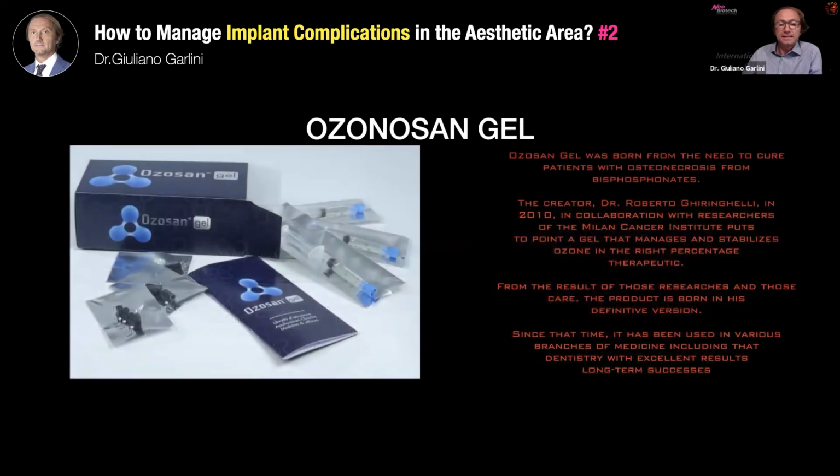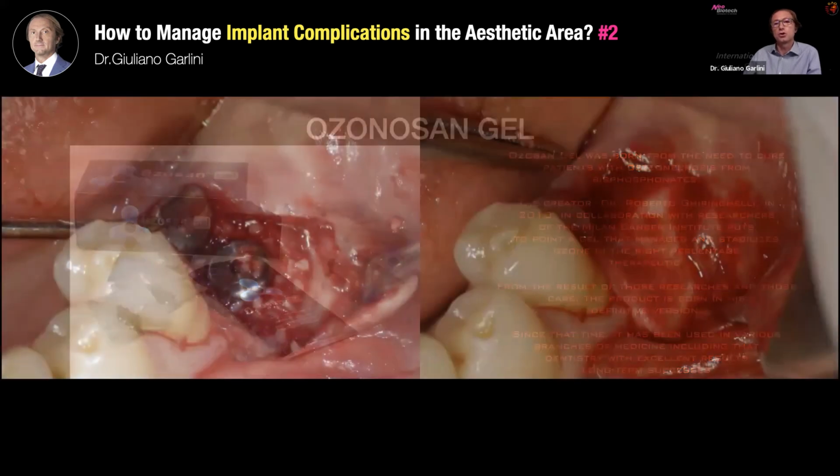And this is a gel that you can put around the implant for 3 minutes. Then you can clean everything and you can go on with your therapy.